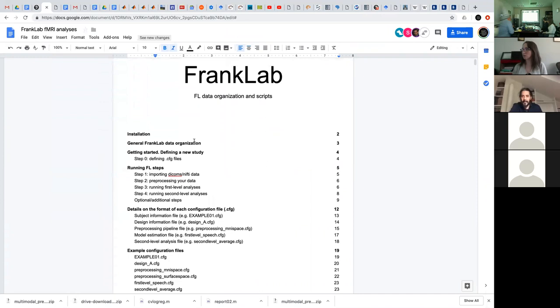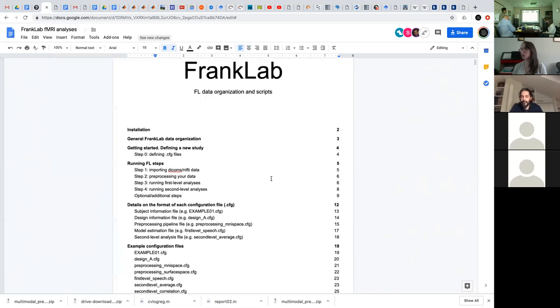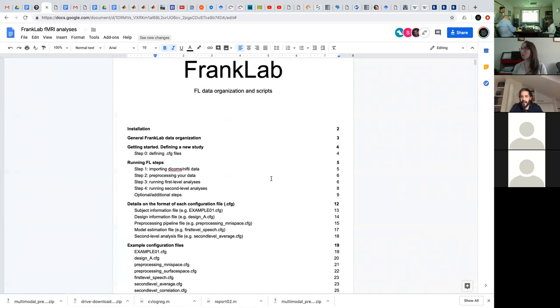I was definitely looking at this yesterday or the day before with some examples that were helpful for some of the things. Yeah, I've been using it a lot as a reference anytime I run stuff. So for the most part, I think it's super helpful. I think the second level is a bit light right now, but I think that's just because it's work in progress. Right. The documentation for the second level is a little bit of a work in progress.